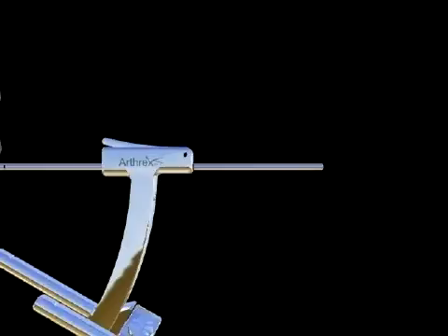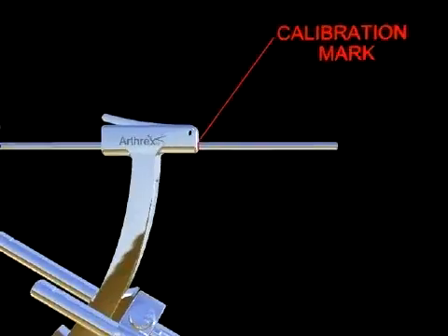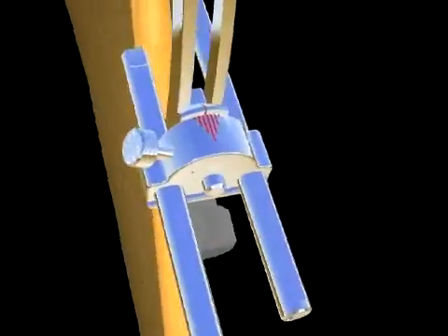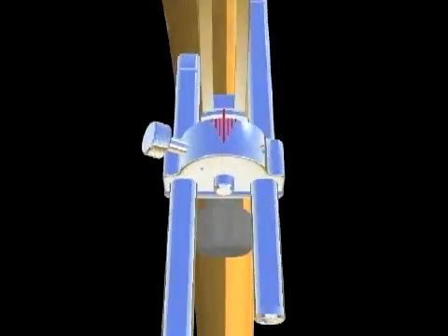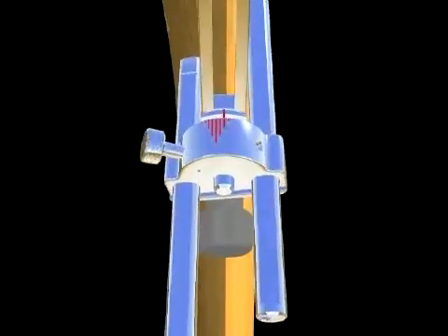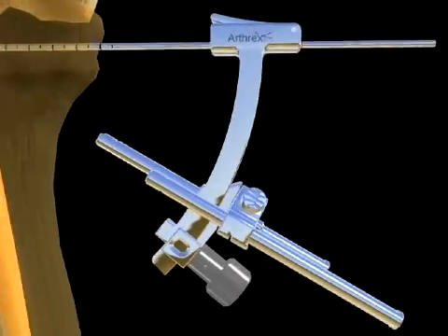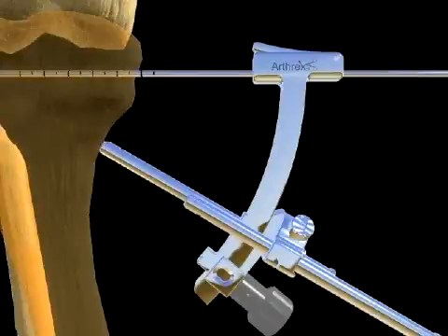The osteotomy guide is then placed onto the 3 mm guide pin so that the rear of the guide is flush with the laser line etched on the guide pin. Alignment of the guide is such that placement of the two 2.4 mm guide pins will be parallel with the slope of the tibial plateau. The parallel guide sleeve assembly can be rotated to make changes to the slope of the tibial plateau if desired. Normally, the guide will be set to 0. The pin sleeves are positioned against the bone.